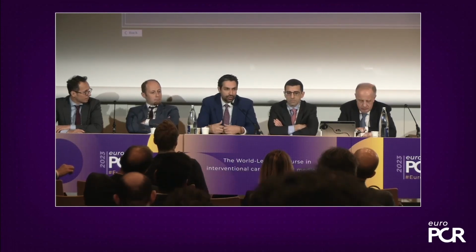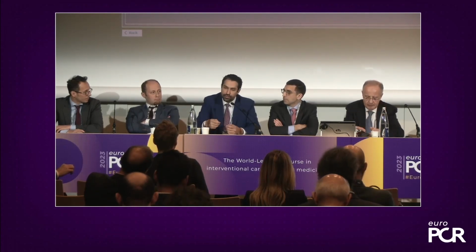We heard, are you ready to share your opinion? Yeah, please. So, thank you, Emanuele. I think that this device is coming along with the developments in the field of coronary physiology, where the pullbacks are becoming more and more important. We're going to see this over the presentations, but one thing is understanding whether the lesion is significant or not, and another thing is understanding how to treat that lesion, and this is the value of the pullback. This device is just helping us perform the pullback maneuver without losing wire position and making things a bit easier. That's a bit how I see this connection.